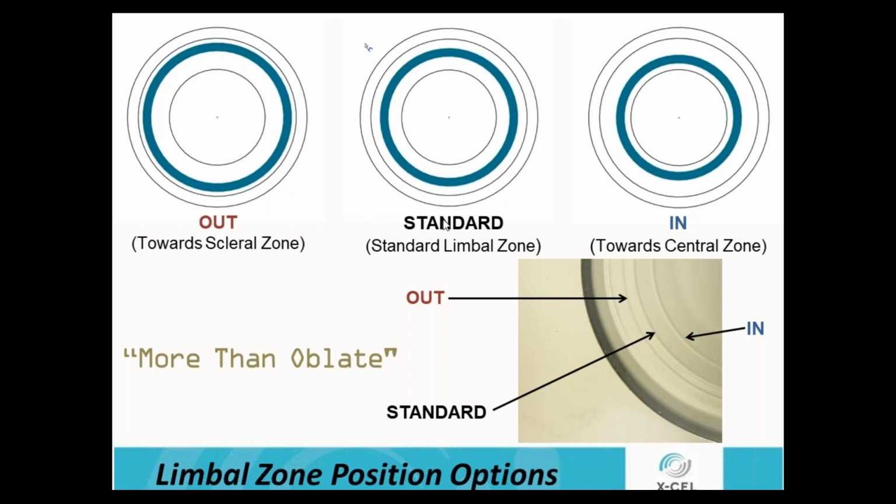This is really nice. This is nice on post-LASIK. So going back to that patient that has a flatter central area, we know that in post-LASIK patients, we're seeing 6-7 millimeters of treatment area or flat area, and then they gradually steepen. And the steepest part of that mid-peripheral or paracentral area is usually at 9 or 10 millimeters.